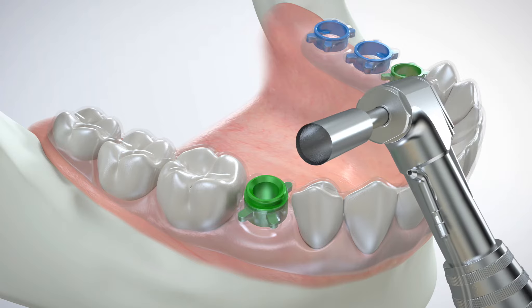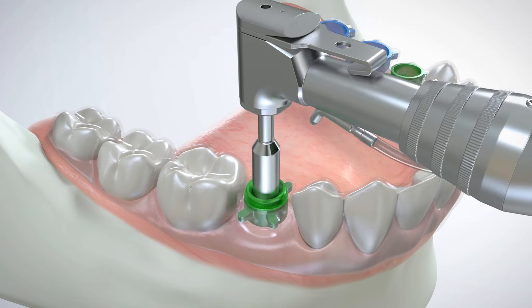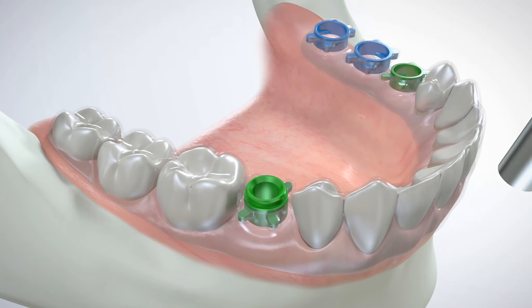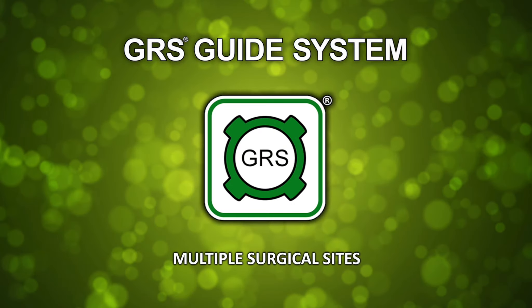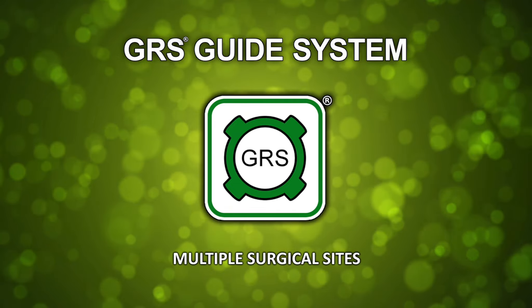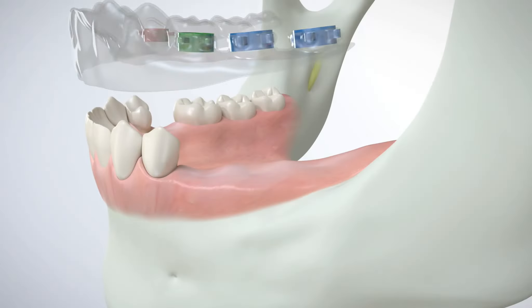A tissue punch is inserted through the GRS drill sleeve, and a small circular area of tissue is removed in the precise location designated for implant placement, guided by the GRS drill sleeve. The tissue punch eliminates the need to perform a full-thickness periodontal flap procedure.